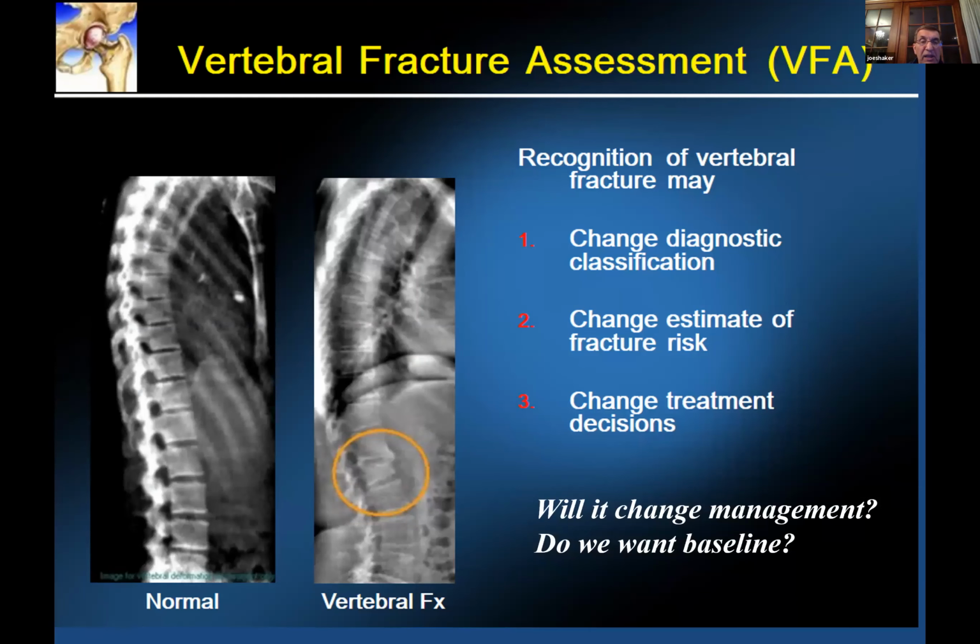So I will typically order my bone density if the place where the patient's going has VFA software. And this is the image you get. This is a normal one. And see this one, this patient has a grade 2 vertebral fracture here.